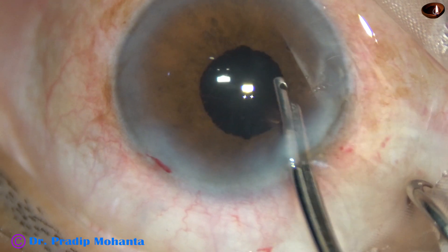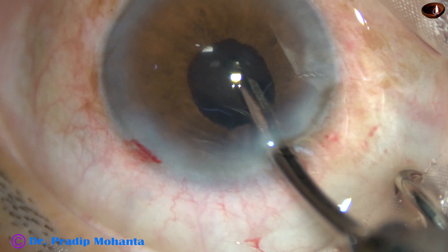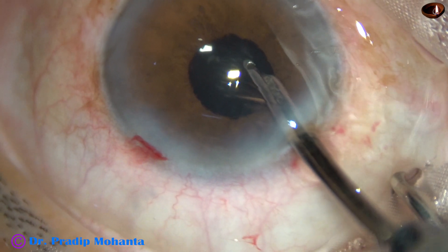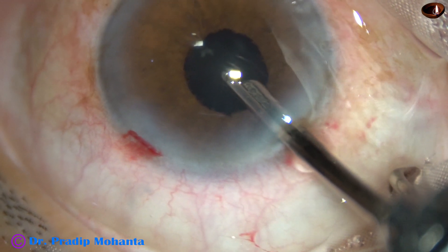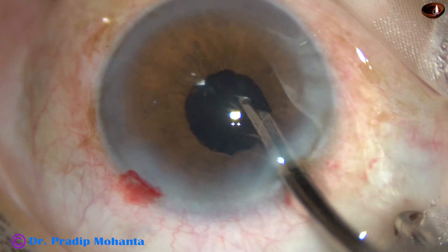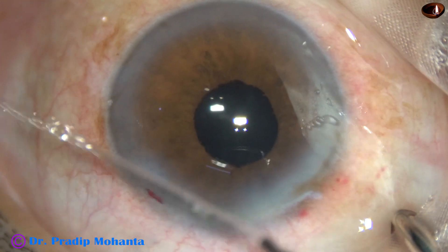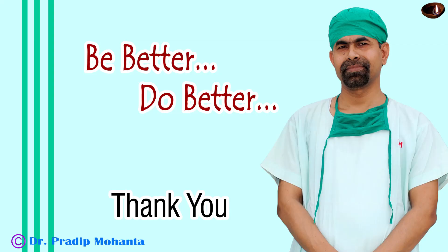Friends, to increase the safety threshold, please use a pupil expansion device in hard cataracts with small pupils. If the cataract is soft you may avoid it, but if it is hard, don't take any risk. The case is being concluded. Thank you very much for your attention. Hope this video will help you in developing your surgical skills. Be a great surgeon and serve mankind affected by cataract blindness, with love, respect, empathy, and great surgical competence. Thank you.